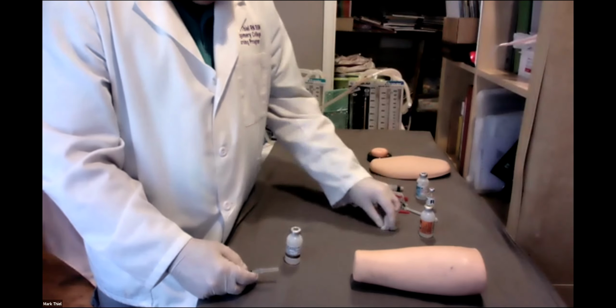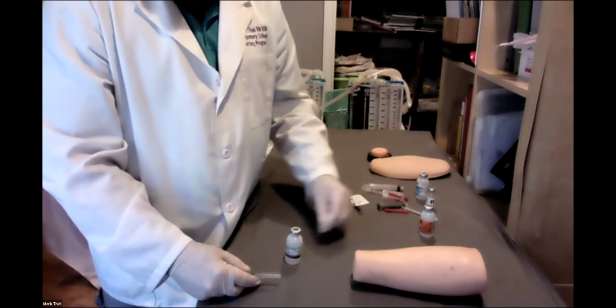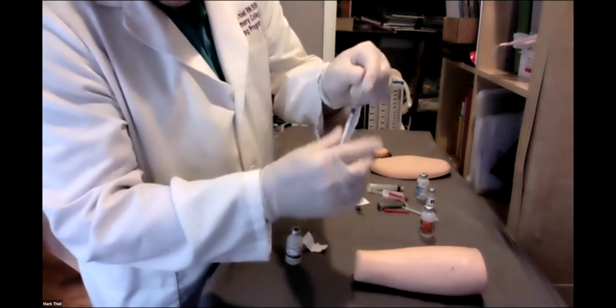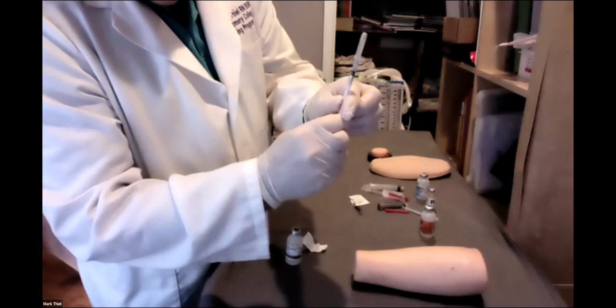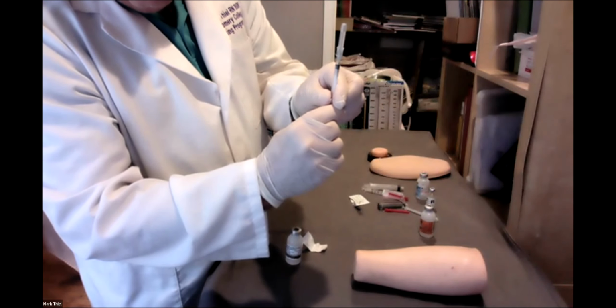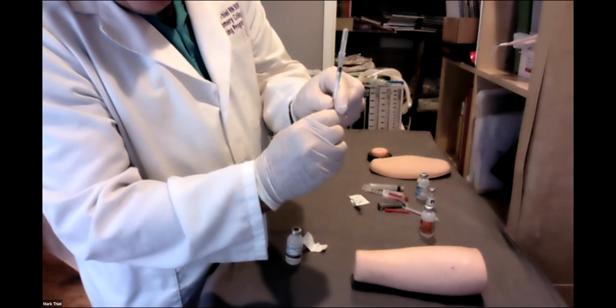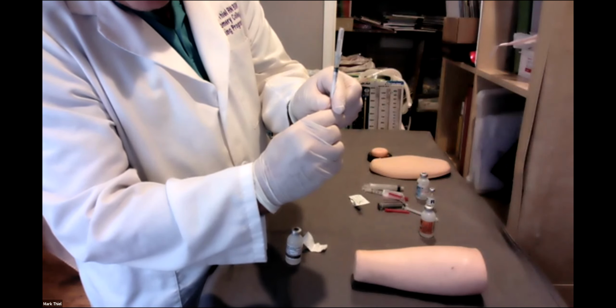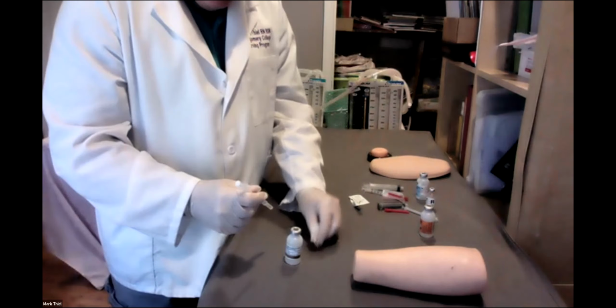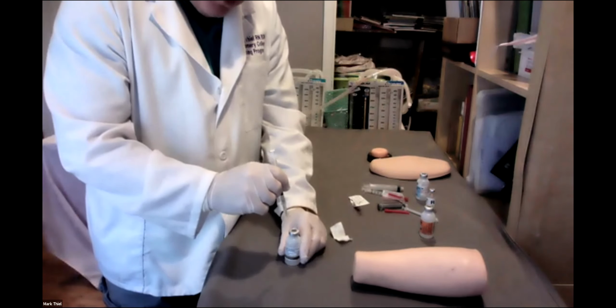Alrighty. For our hub, what do we do first? You can leave your cap on. Draw air to the 0.1. Very small dosage, isn't it? I scrubbed.